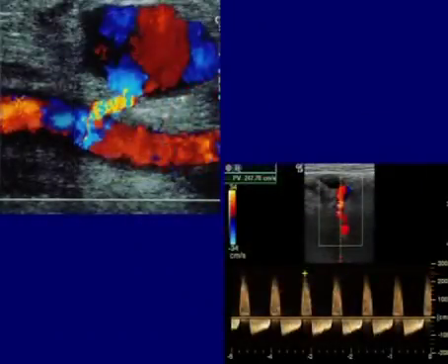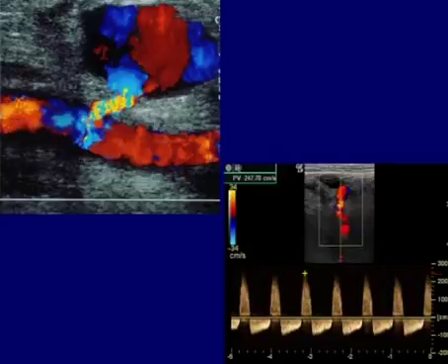We know we're dealing with an aneurysmal problem here. Here's an illustration showing a pseudoaneurysm. Here we have the feeding artery coming on down, the neck or the track of the pseudoaneurysm leading to the sac of the pseudoaneurysm out here, again showing all the color swirling.